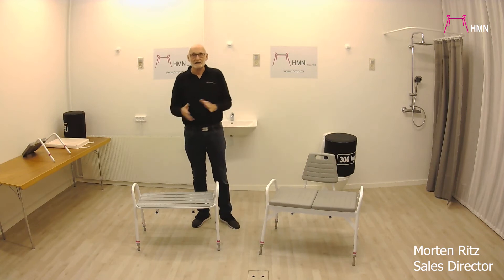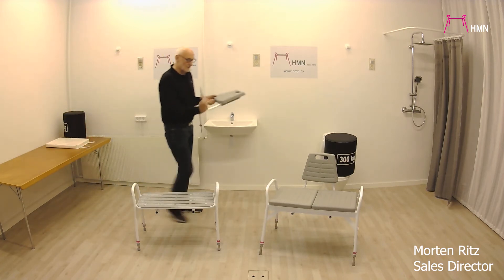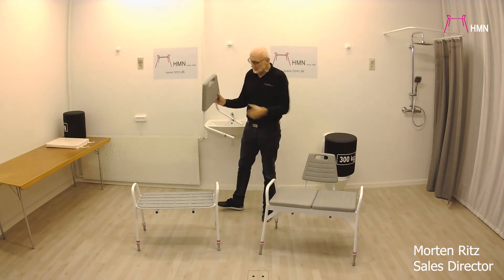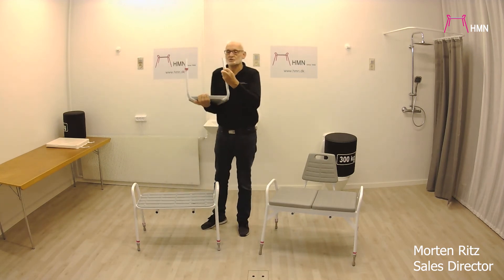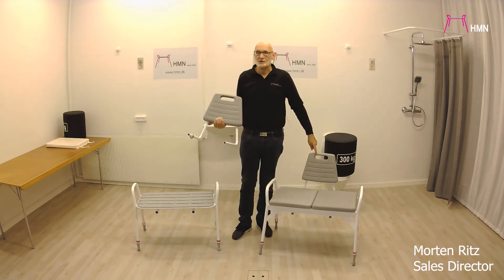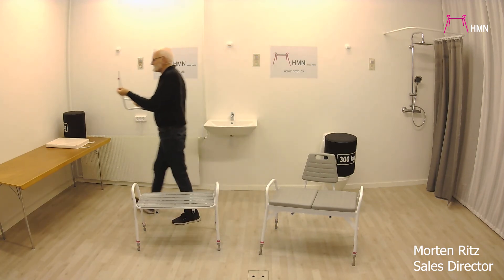Both of them are of course height-adjustable, and for both you can get the backrest. These backrests are actually the same for both. We have mounted one here on the 300 kg model, but for both of them you can see there are tubes here where you can put them in. There are two adjustment positions so you can move it further back, which is useful when you have a 300 kg user, allowing you to place it slightly further back.